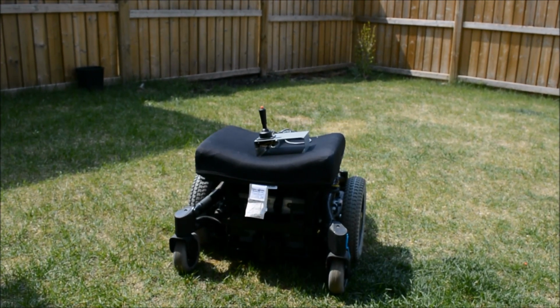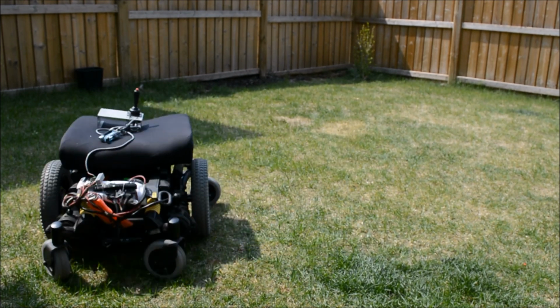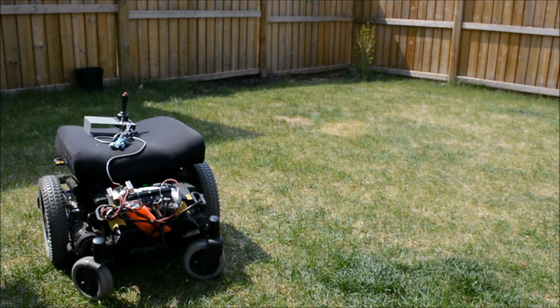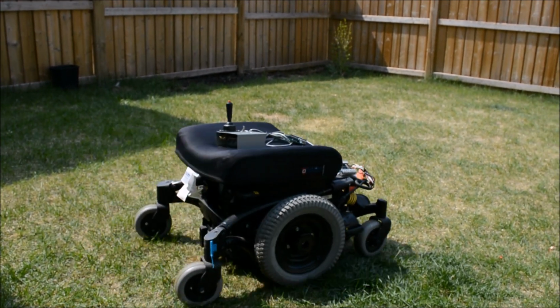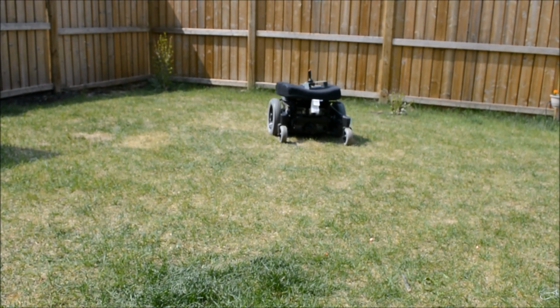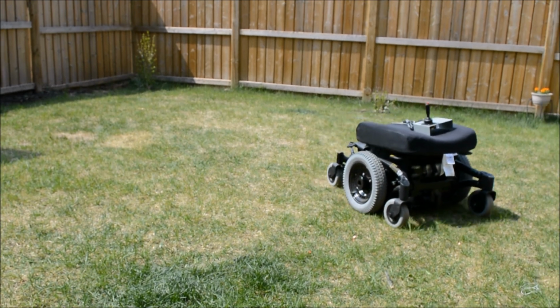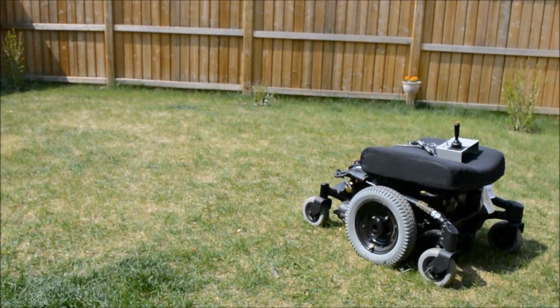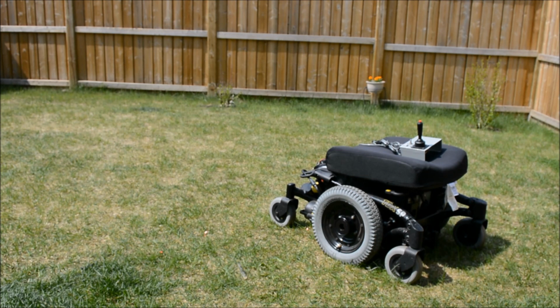And if I want to go left, I have all the controls of the wheelchair already, and I can go more left. And if I go forward plus and forward left, it will slowly move the wheelchair forward left. And that's all the controls for the wheelchair through the Bluetooth module I have. You can fully control the wheelchair without using the joystick, just directly through the Bluetooth of the Android application.